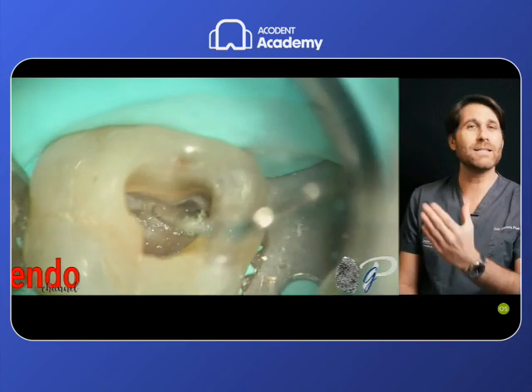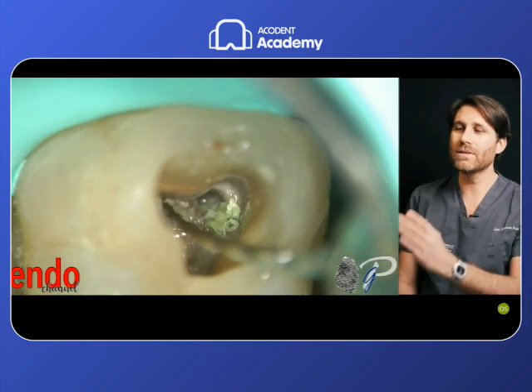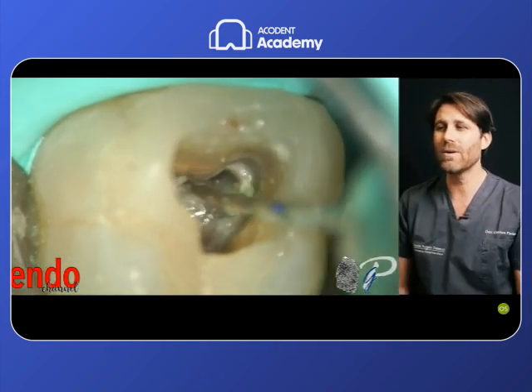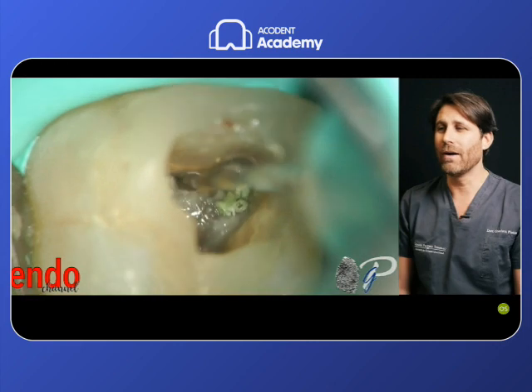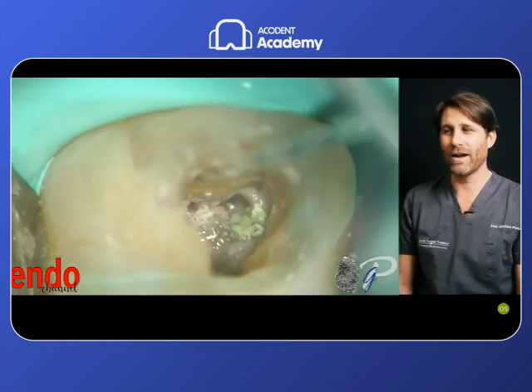The manual file doesn't work at all, so the other strategy we can use is a tip size 25 taper 8 that is a powerful instrument. In this case it was a Reciproc M-Wire that was available at the time on the market, and look how easily it can penetrate this kind of anatomy.